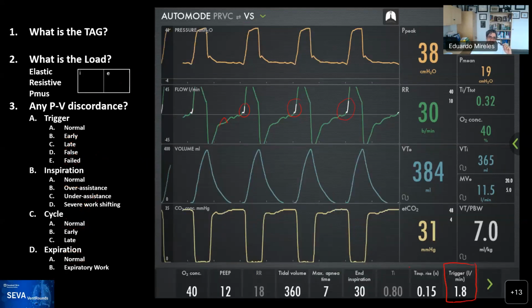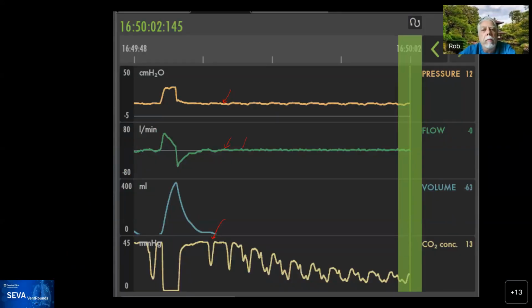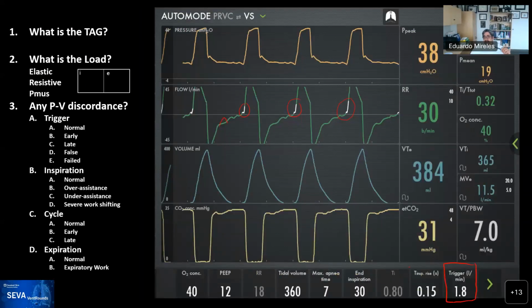So the outstanding feature of this case is that the patient was supposed to be paralyzed. Couldn't this happen on somebody who wasn't getting a paralytic? Yes, it can, and then actually later you're really screwed. When I met this patient, the patient was having exactly the same thing, but the paralysis and sedation had been stopped. The patient was still deeply sedated, and had switched again to volume support because it seemed that it was triggering, but the patient was in La La Land.